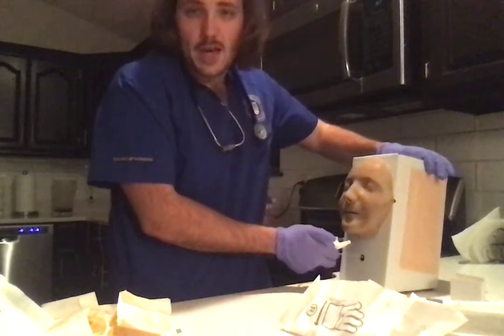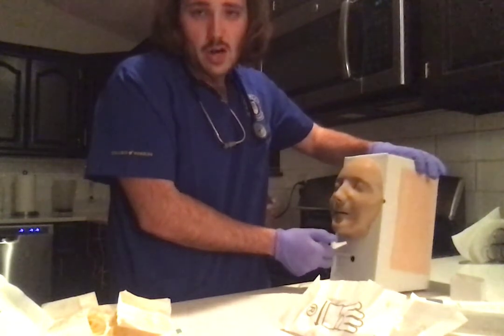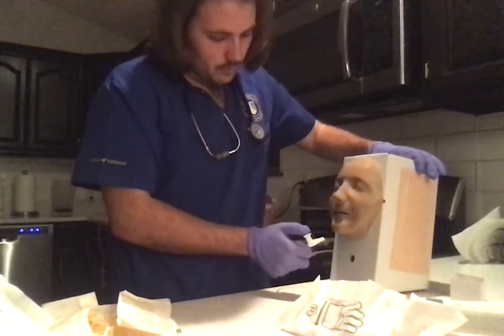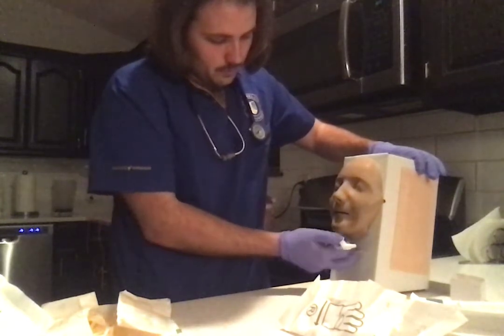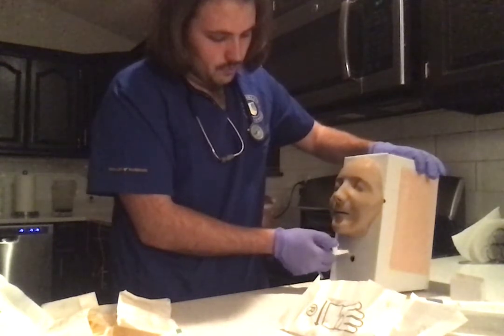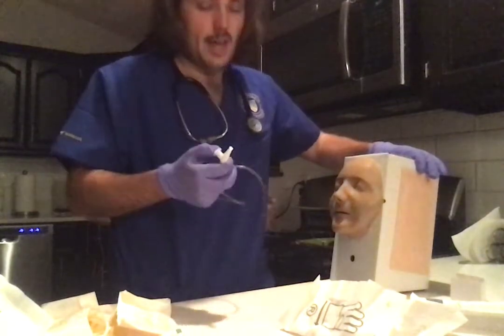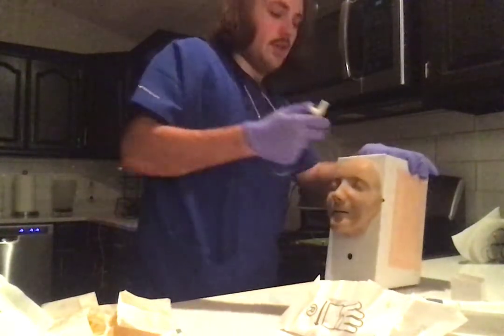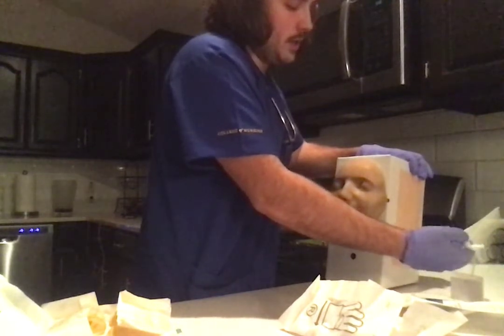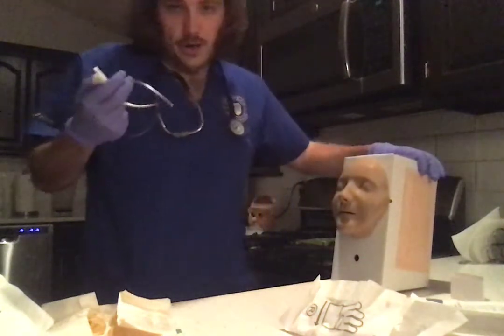Suction does not want to last longer than 10 to 15 seconds. At that point, you'll just start drying out the mucosa. Okay, after that first pass, we're going to use our saline again and rinse. Get some cleaning done in this tube. And then we're going to repeat again.